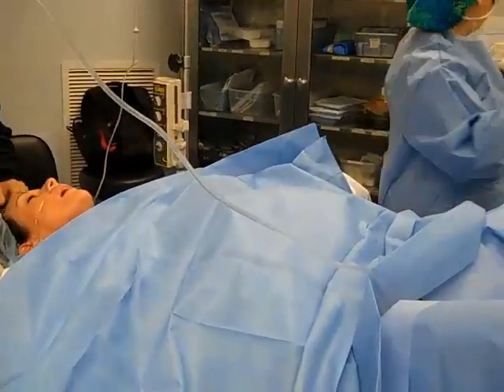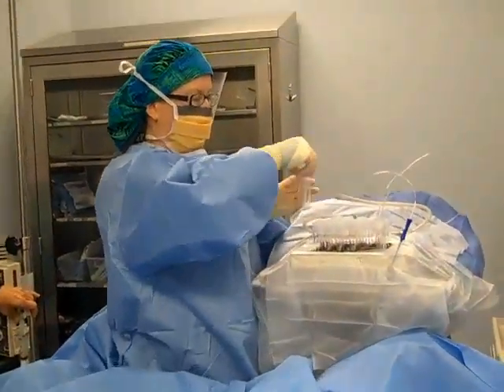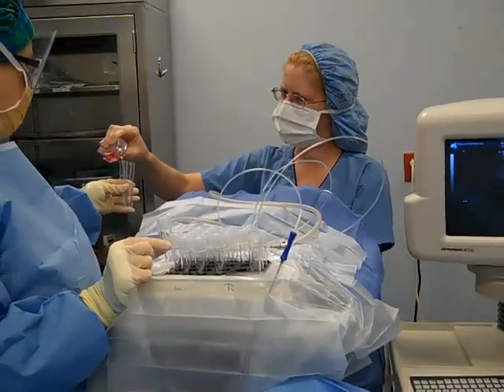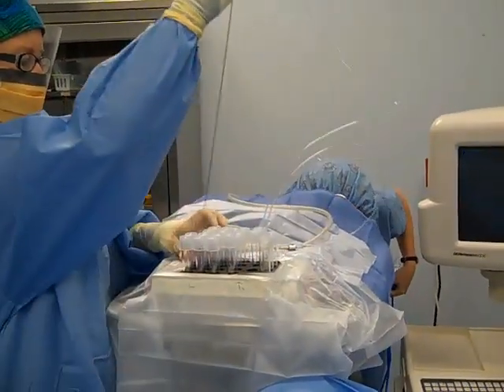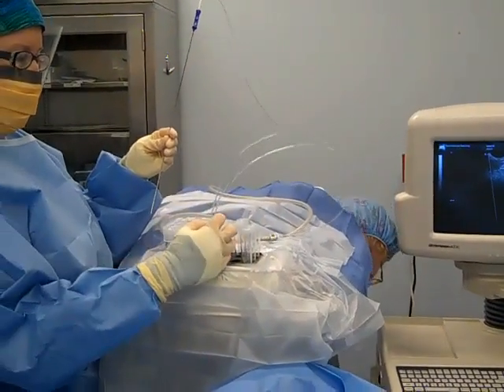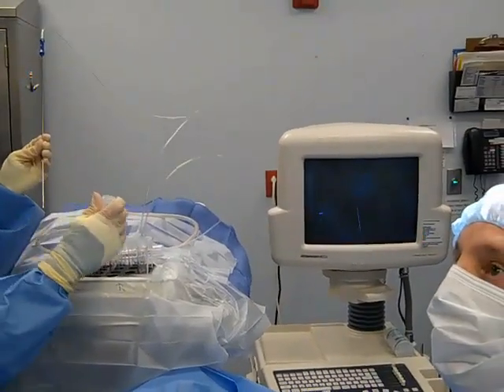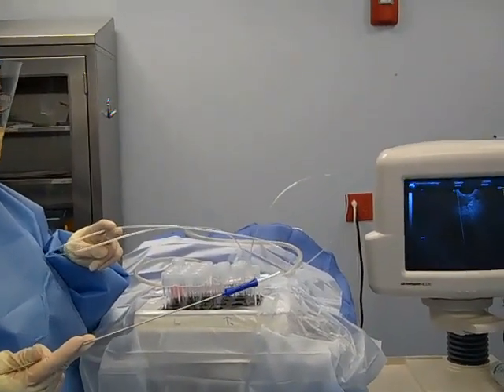So this is Liz now. She's completely comfortable under anesthesia, and we're going to begin the egg aspiration procedure. For many of you who will undergo the procedure, it's completely painless — anesthesia is given. The term 'test tube baby' comes from the fact that we're using test tubes to collect the fluid that surrounds the eggs. It's put into a media, and everything is kept under sterile conditions, temperature sensitive, and pH balanced.